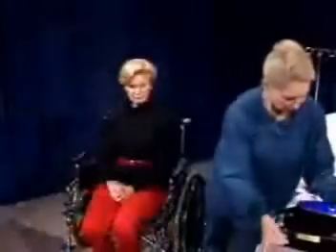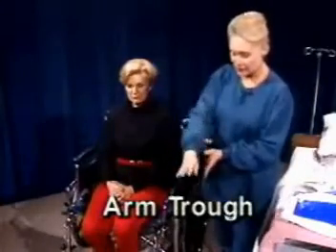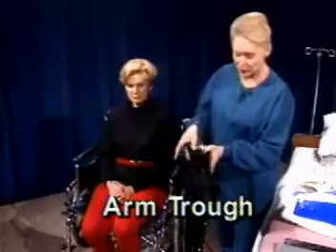We're going to be looking at a second positioning device now, called a trough. It rather resembles a trough. Again, it's easily cleaned and should be kept clean for the patient, and it slides in like manner onto the wheelchair. Before we position a patient's arm into the trough, it should be all the way back to the wheelchair.